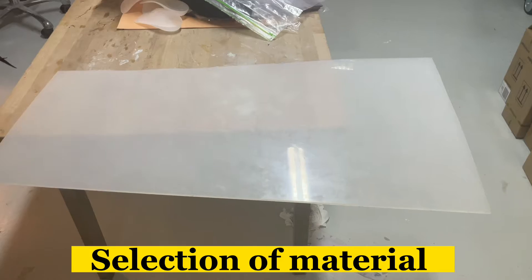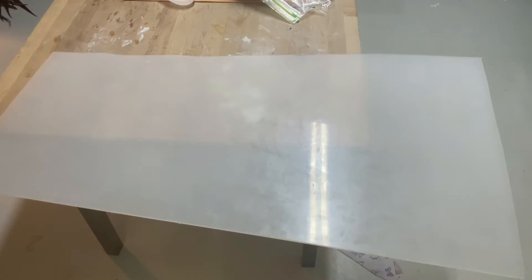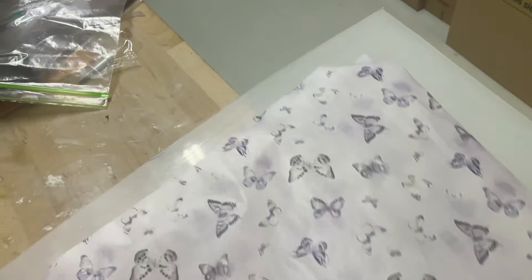Assalamu alaikum, nazareen. I hope you all are fine. In this video I would like to explain a simple process of molding. For molding, we need a material — we have to select a proper material.